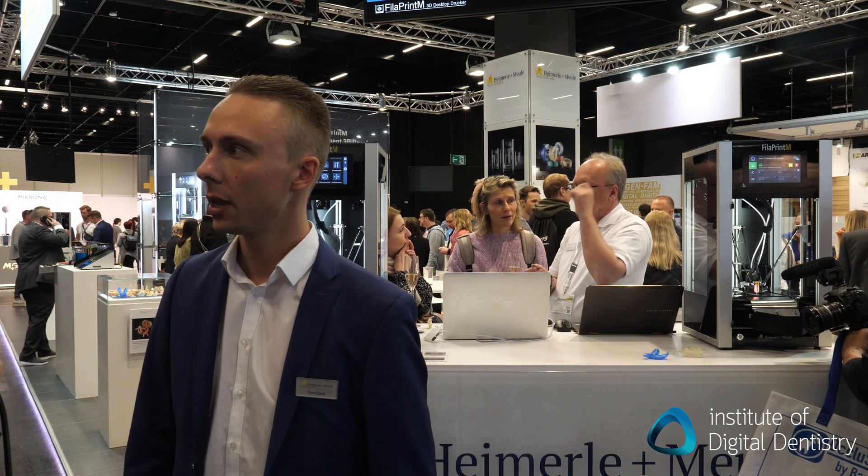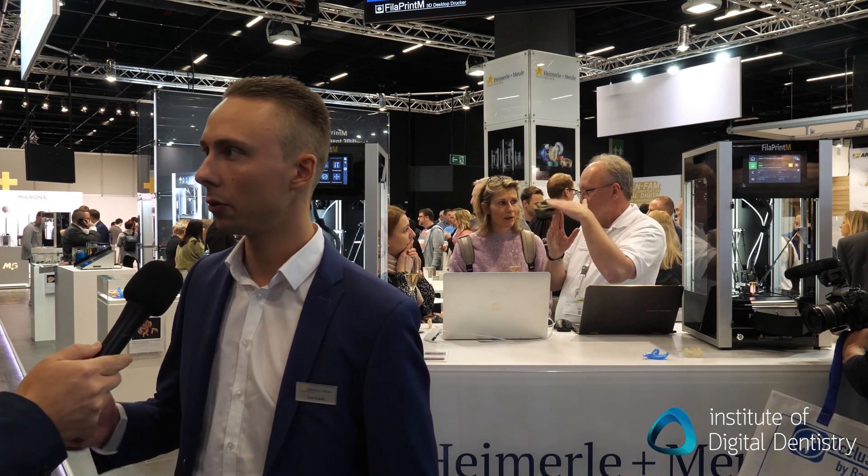What sort of speed are we talking about? For a tray, for example, we are around one hour printing time. And for crowns, one and a half to two hours.